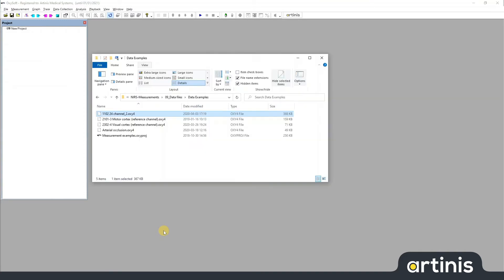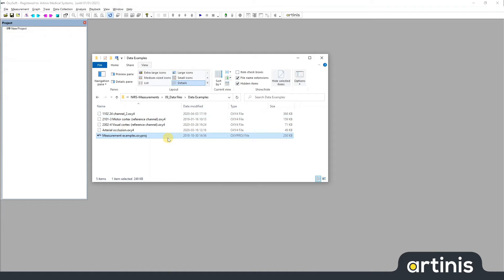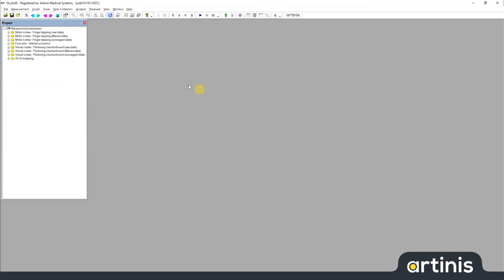I will illustrate this now with our measurement examples project. The folder that you can see here contains all the data and the project file that makes up the measurement examples project. You see the project file here and you see the four different .oxy4 files up top. If I now open this file in OxoSoft, you can see that there are actually eight measurements.